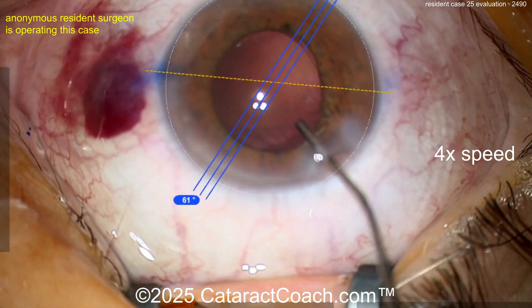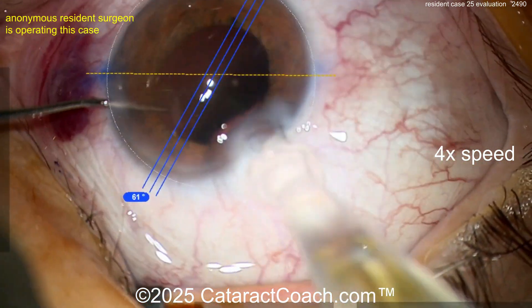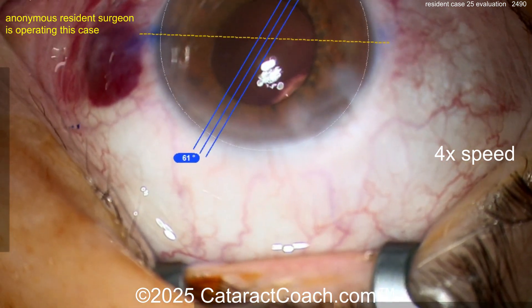You need to keep the eye in primary during nucleus removal and cortex removal. Do all these little steps to make yourself a better surgeon.